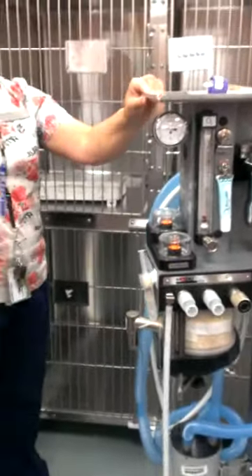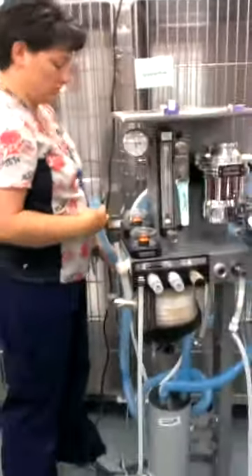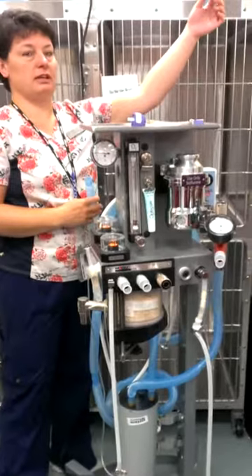There are three things that have to be plugged in: power, the scavenger, which got pulled apart inappropriately yesterday.